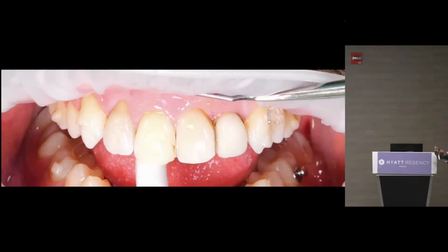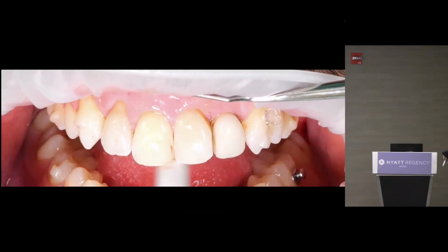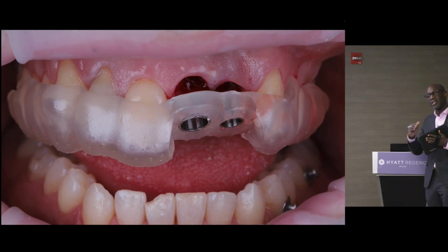So as we do the surgery, I'm not going to make you sit through the video here. There is a video as we go through the surgery. But in terms of time, because the teeth were ankylosed, we've done a technique called socket shield. And this is a really delicate technique from a prosthetic perspective, because if we push on the shield at the time, if we have the wrong shape of subgingival component, we can cause everything to fail.